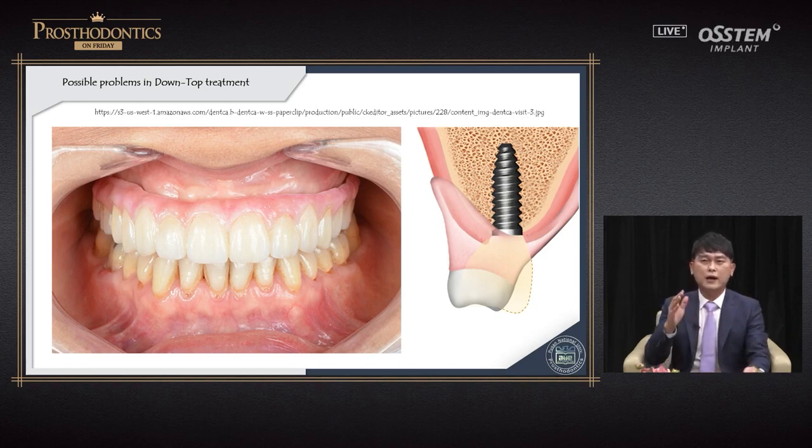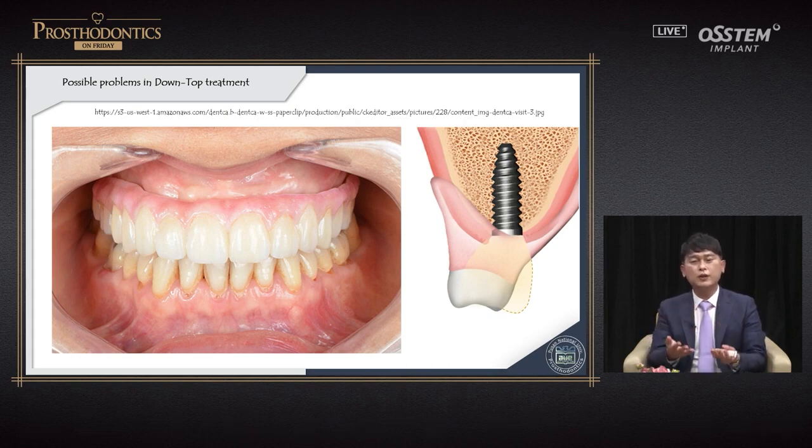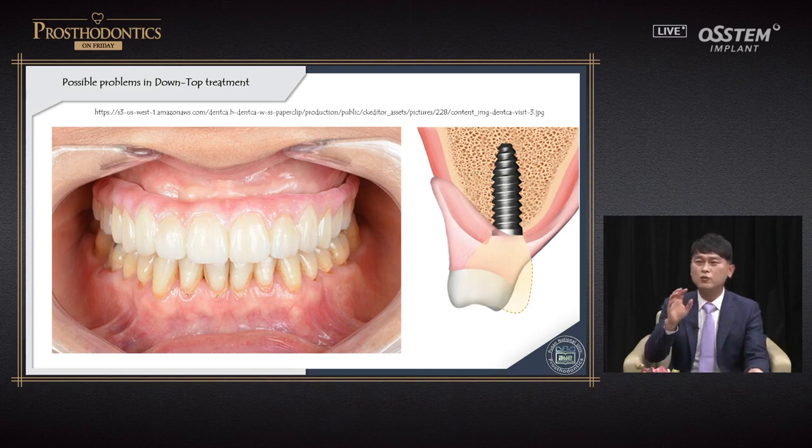Magic 4 is tightened with screws, so cleaning is difficult. So there is a gap in the soft tissue part. You can see the gap between the prosthesis and gingiva. To clean the area with a water pick, we can do this. But if you look here, even a healthy patient, when the patient is old, it is difficult to use a water pick. And there are people who want to have a thorough cleaning.